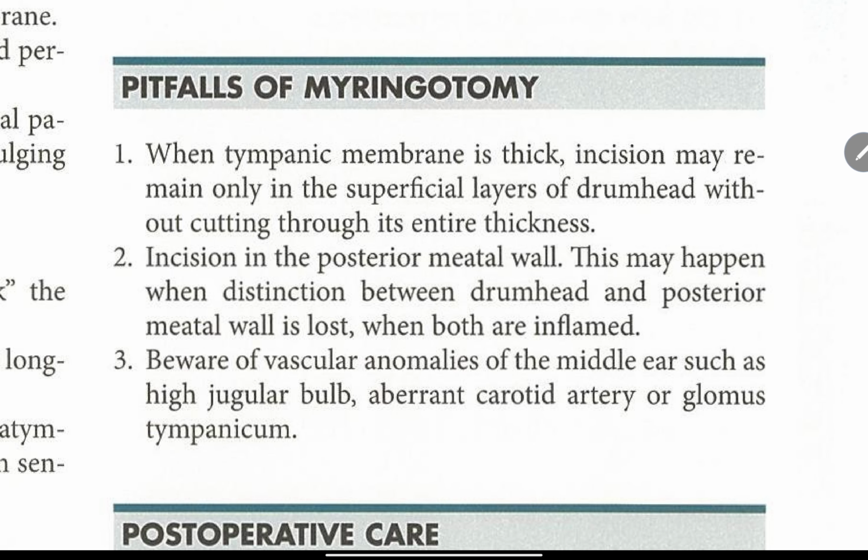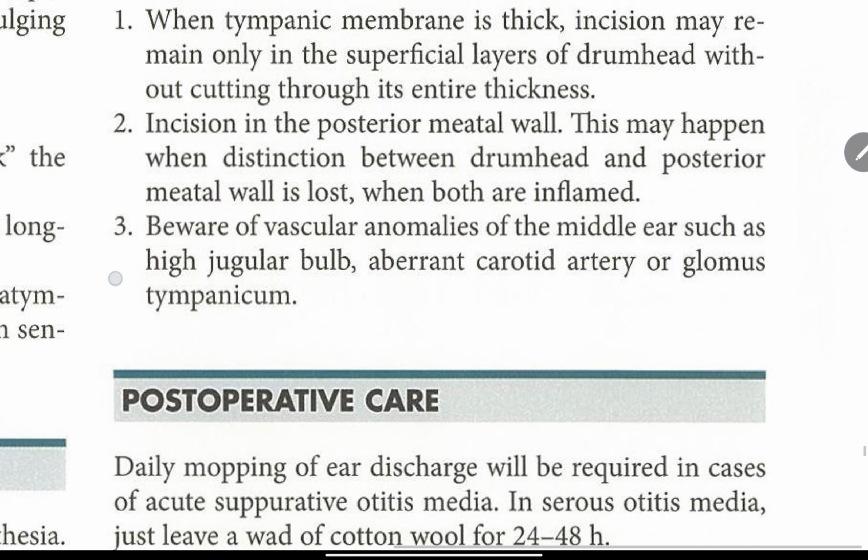Pitfalls of myringotomy. 1. When tympanic membrane is thick, incision may remain only in the superficial layers of eardrum without cutting through its entire thickness. 2. Incision in the posterior meatal wall. This may happen when distinction between eardrum and posterior meatal wall is lost, when both are inflamed. 3. Beware of vascular anomalies of the middle ear, such as high jugular bulb, aberrant carotid artery, or glomus tympanicum.